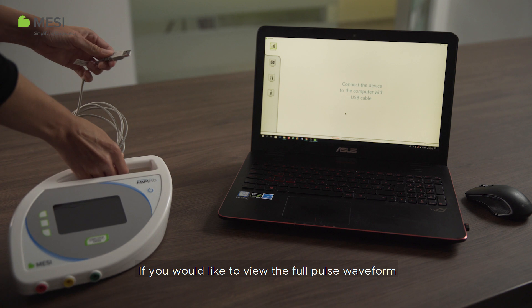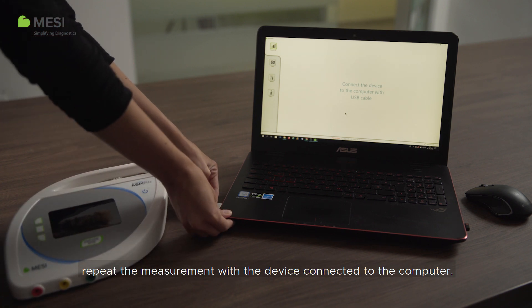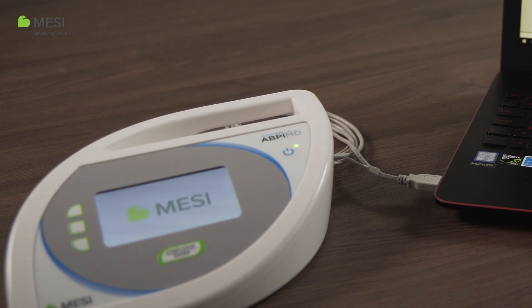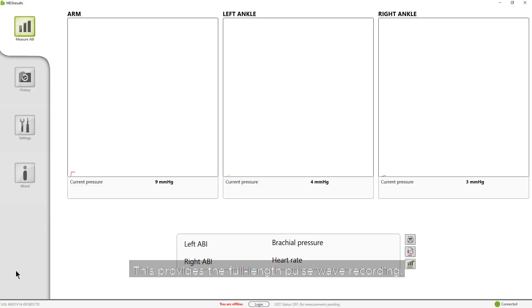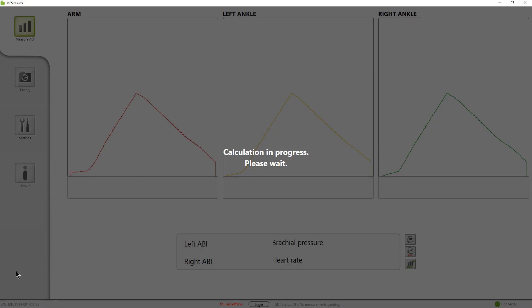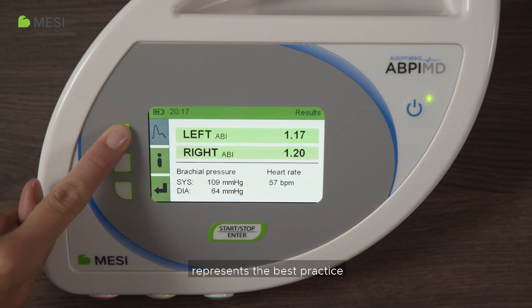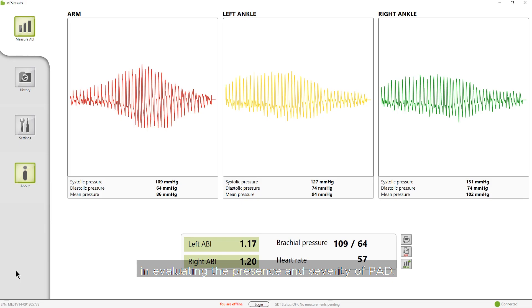If you would like to view the full pulse waveform, repeat the measurement with the device connected to the computer. This provides the full-length pulse waveform which can be analyzed to confirm the condition. Combining both ABI and the pulse waveform represents the best practice in evaluating the presence and severity of PAD.